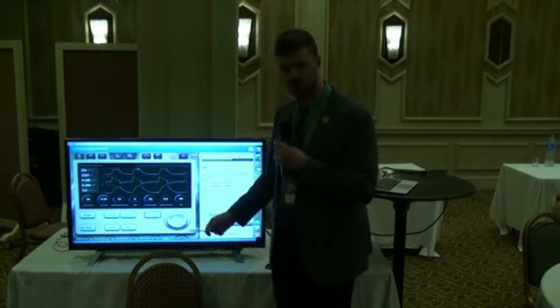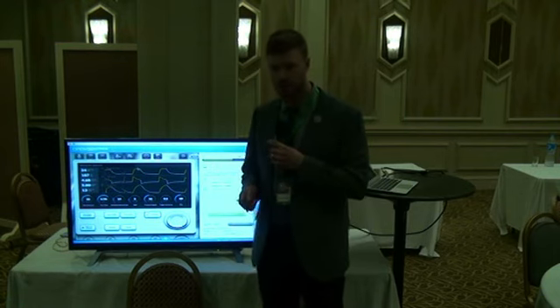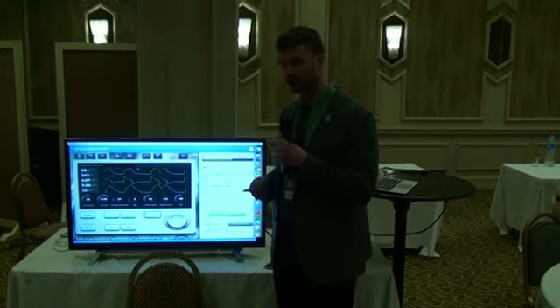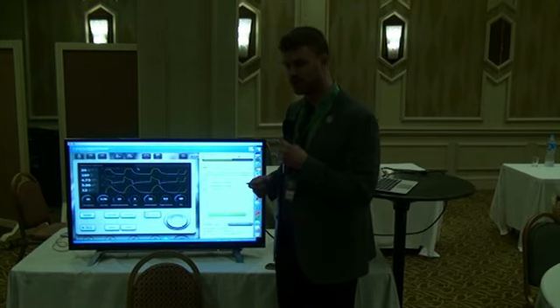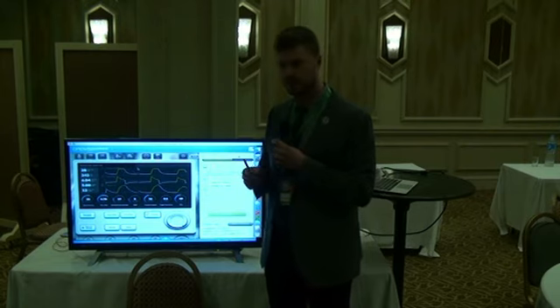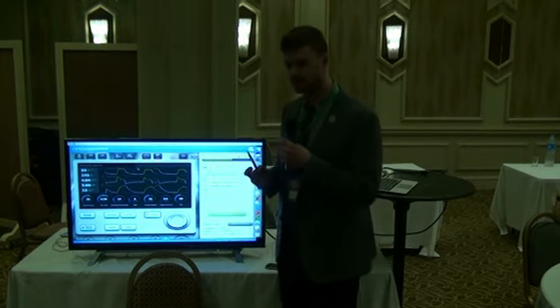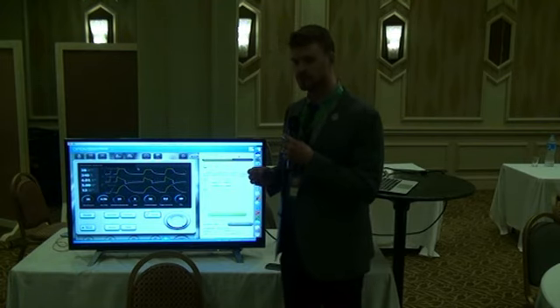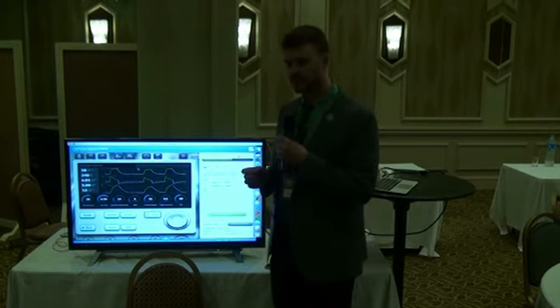So we want to ventilate more. Give him more space for expiration. More space for expiration. Yep. More time for expiration. Sure, how are you going to do that? What do you want to do? Shortening the expiratory time. Shortening the inspiratory time? Shortening the inspiration so you have more time for expiration. Yep. And maybe not making the frequency too high so you also have space for expiration.